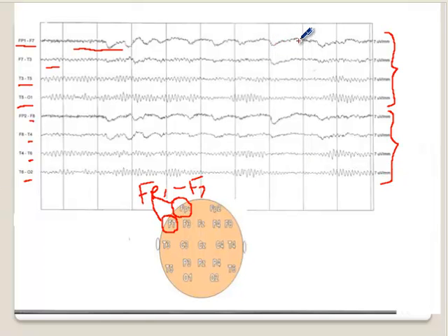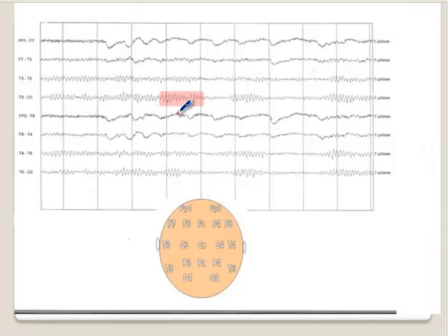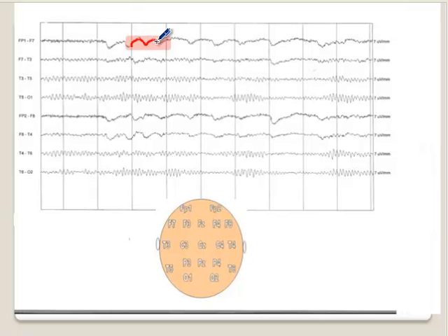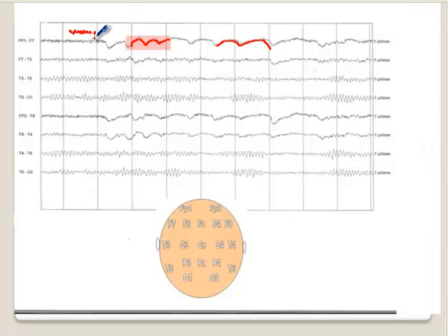In a normal EEG, the beta frequencies are more prominent in the frontal head region, and the alpha frequencies are most prominent in the occipital head region, specifically during quiet wakefulness. This highlighted region shows the alpha frequency — we call it an occipital dominant alpha rhythm. And you have the fast frequency, but underneath that fast frequency you also have slow waves — these are delta waves. So you have delta frequency with superimposed beta frequency. Here you can see this beta frequency highlighted.